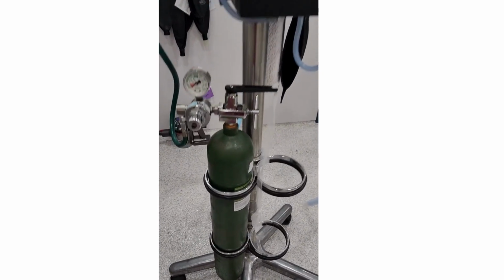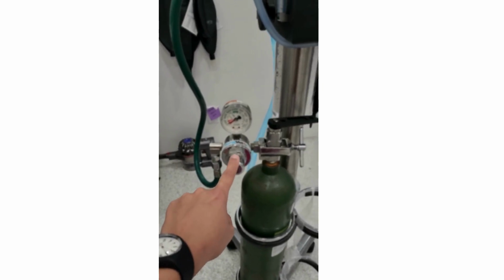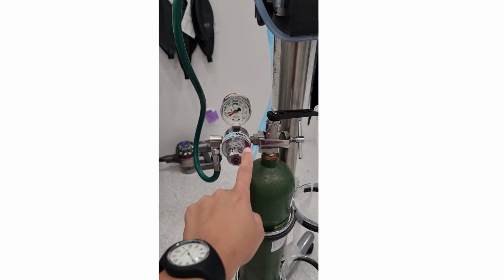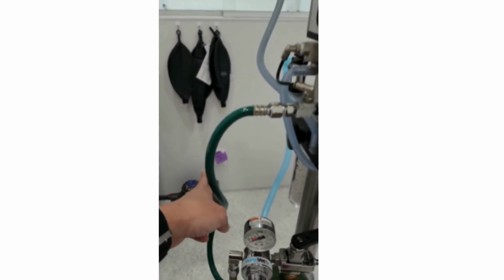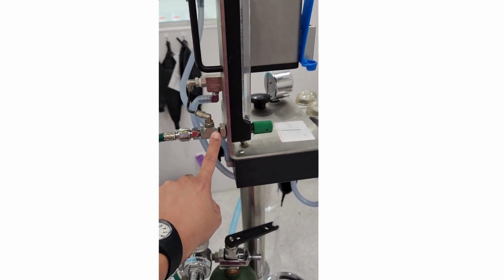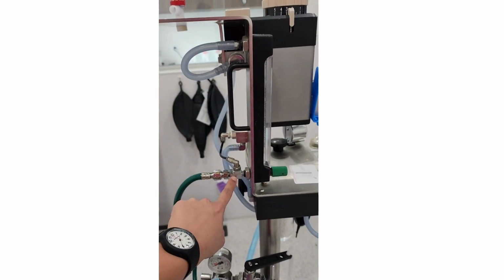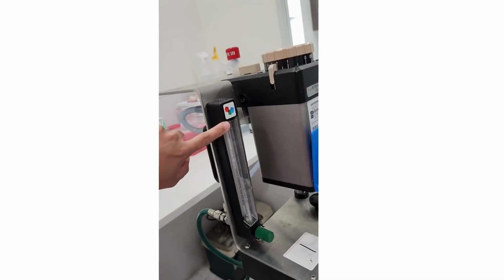Now we're going to go over the anesthesia machine. You always want to start from the green tank, which is the oxygen tank. It works at a high pressure of 2200 psi. Then we have the regulator, which is going to reduce that pressure to 50 psi, which is more suitable for the anesthesia machine. It also has a manometer, which tells how much oxygen is left. From here, the oxygen will reach the anesthesia machine through a hose, and then it can take one of two paths, either the flow meter or the oxygen flush valve.